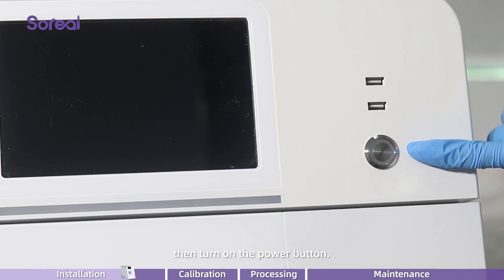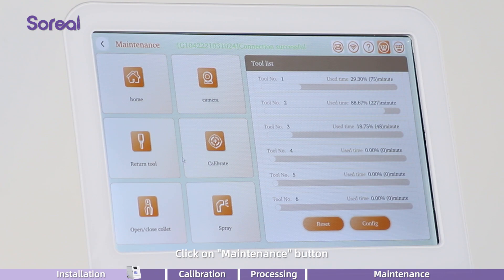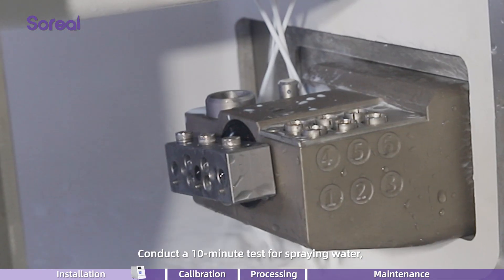Close and tighten the water tank drawer. Then turn on the power button. Click on the maintenance button, followed by water spray. Conduct a 10-minute test for spraying water.